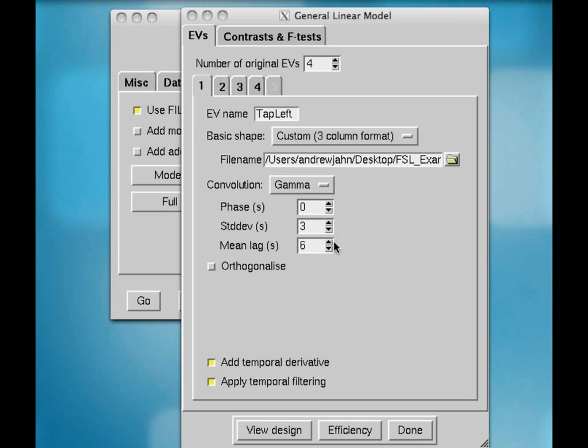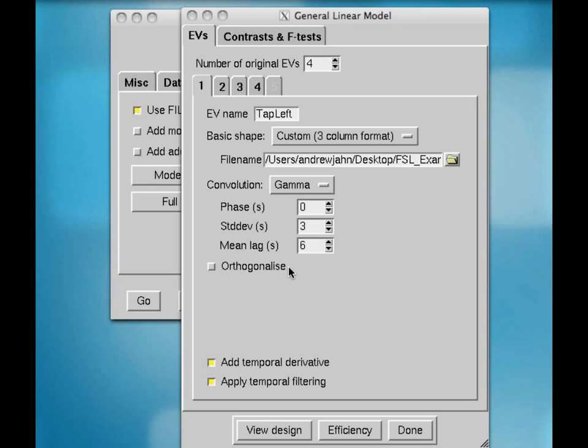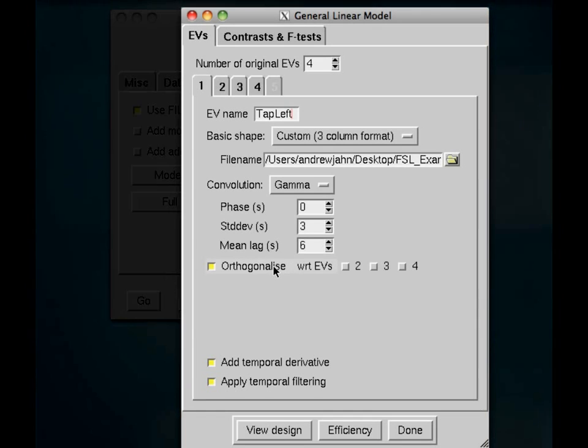The rest of these are fine. Don't worry about them. Orthogonalized. Do not do this unless you have a very good reason to believe that you know that all of the variance should be placed under this variable as opposed to any of the other variables.